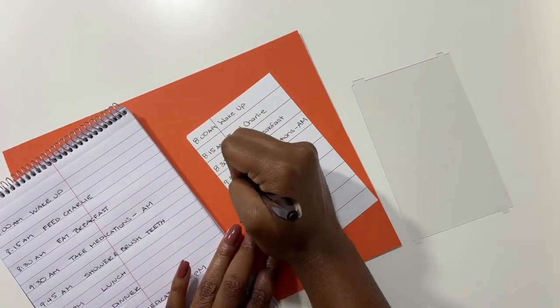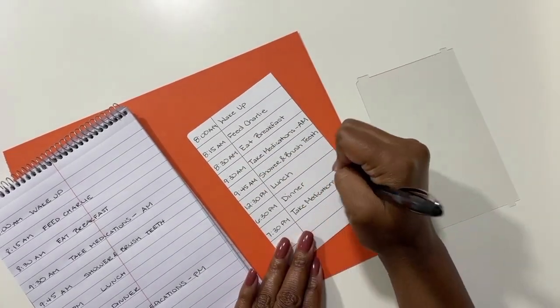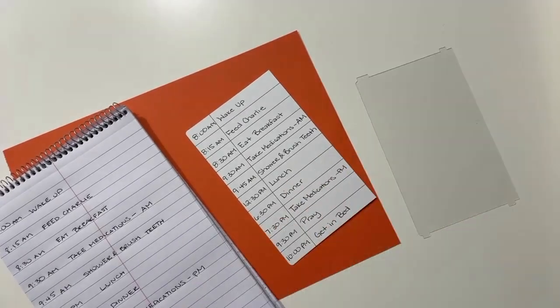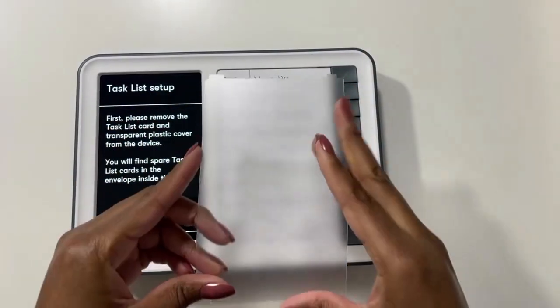I did all ten slots, but you don't have to. Also, there's only four extra task lists, so be careful not to mess up. Then we'll replace the task list followed by the plastic cover.